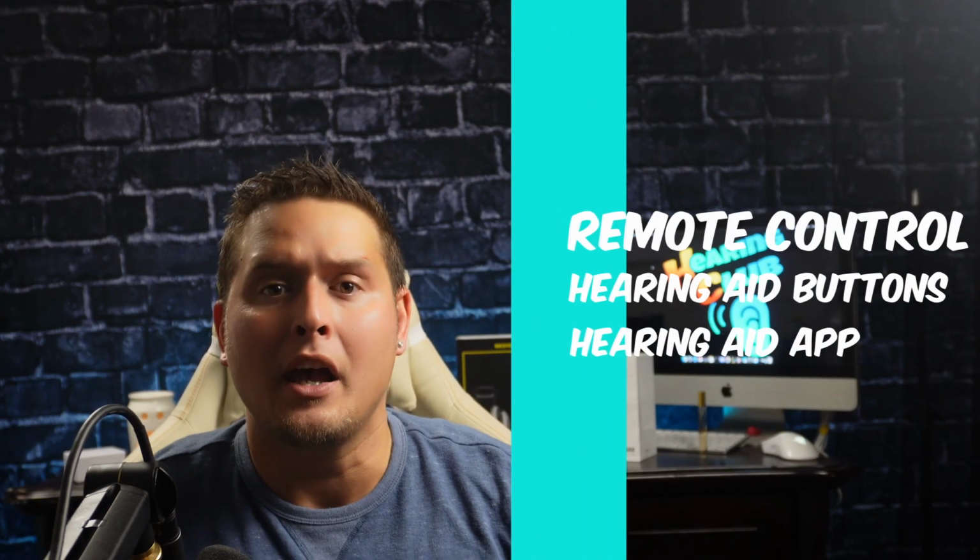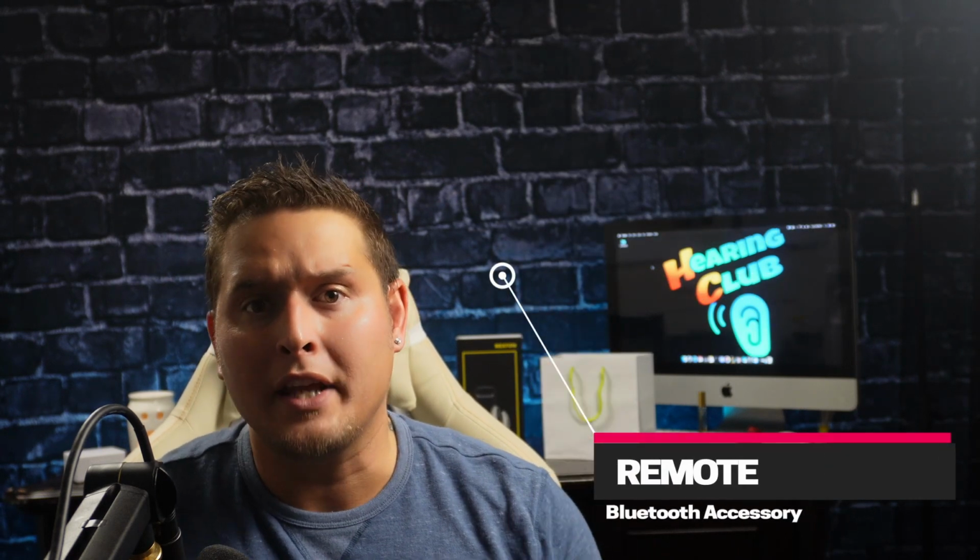With most hearing aids, there's accessories that are available. And one of those accessories is a Bluetooth remote. It looks something like this. It's a very basic remote with big buttons, and you can change the volume on your hearing aids, and you can also change the programs on your hearing aids by just pressing one of these buttons. You could switch from your all-around program to your restaurant program or your music program. Some hearing aids have a television program.